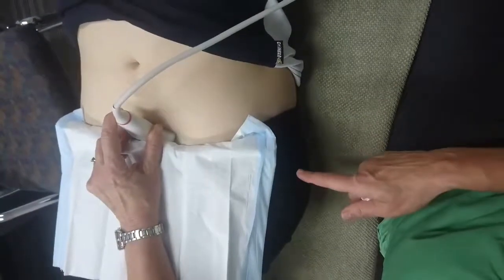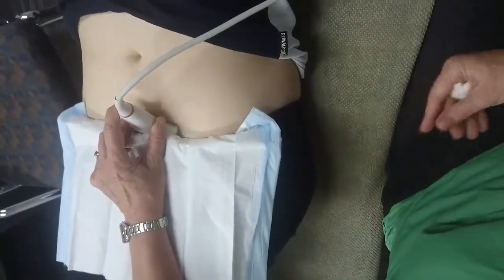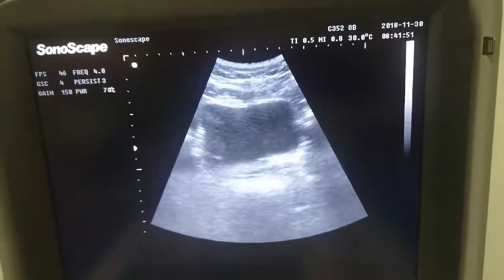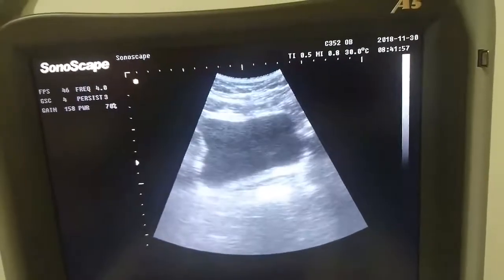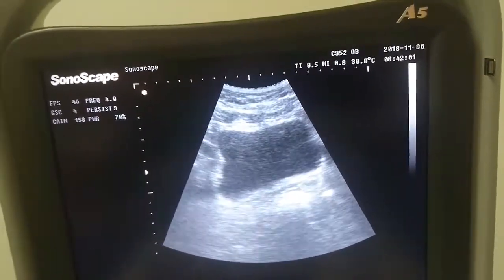So this is where we ultrasound. I put the ultrasound on the bottom of the ladies' or the gents' tummy, and then we can see on the ultrasound — on the television screen — your bladder. That irregular circle in the middle of the screen is this lady's bladder. At the bottom is where the muscles sit.